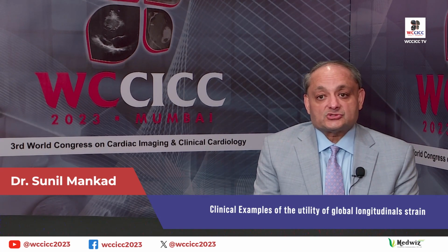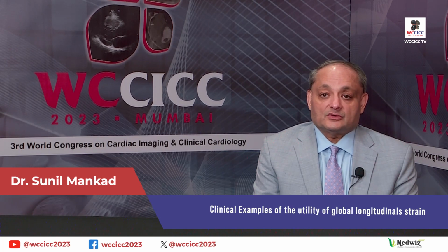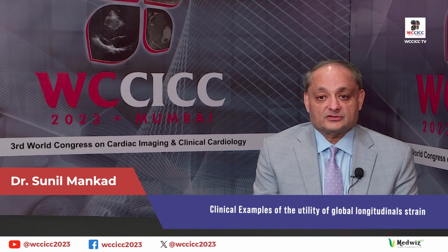We also utilize strain imaging to detect subclinical LV dysfunction in patients on chemotherapy. Certainly, patients that develop cardiac dysfunction on chemotherapy can be quite serious and often can lead to eventually problems with heart failure and even death. So detecting that and being able to prevent further deterioration is important.